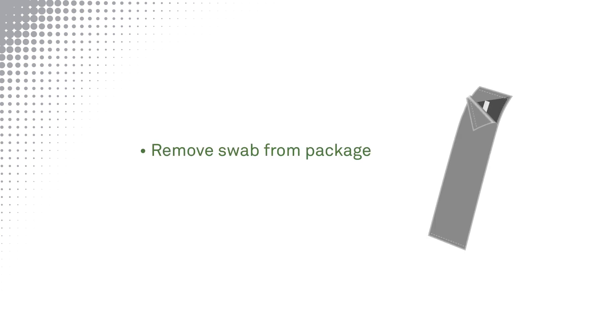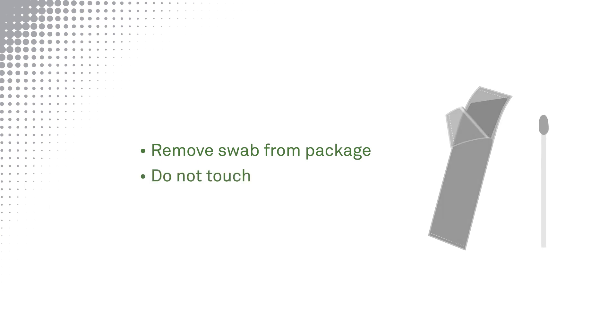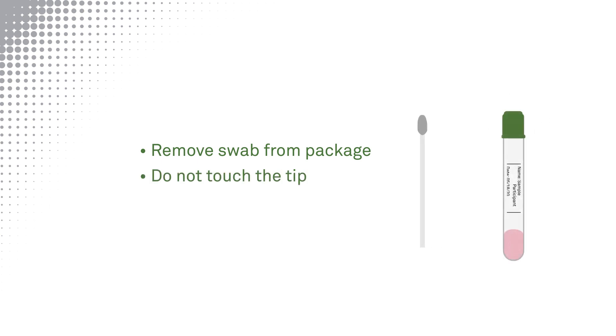Remove the swab from the package and do not touch the tip of the swab. Open the specimen tube holding it in one hand and the swab in the other hand.